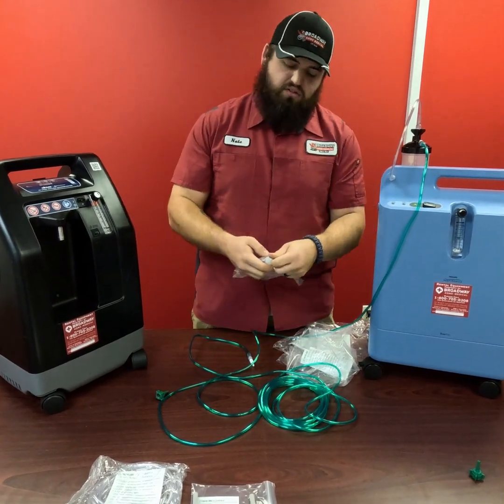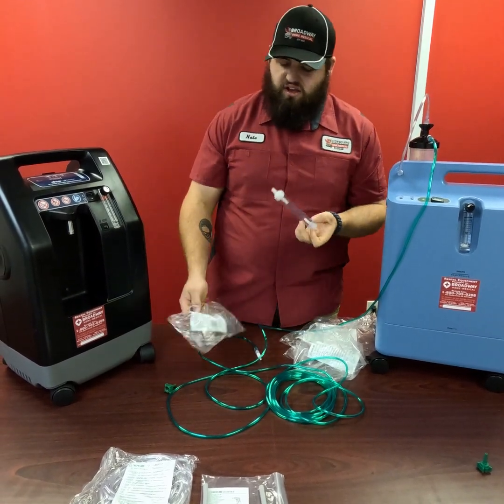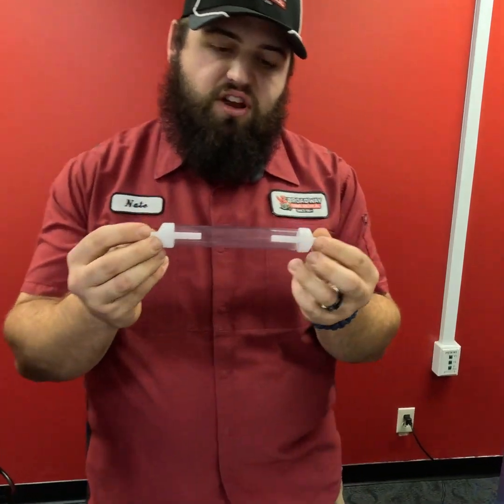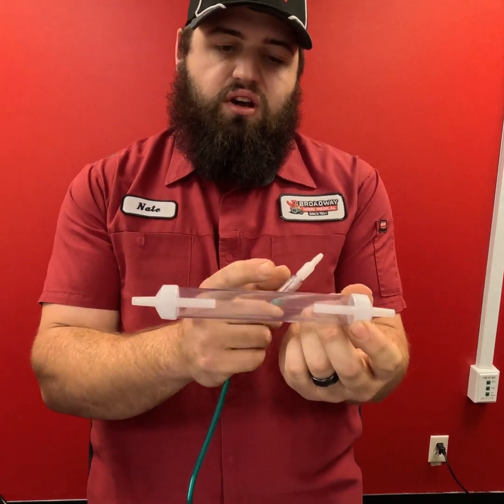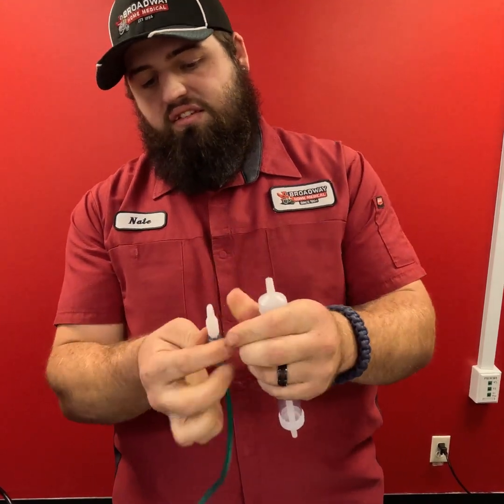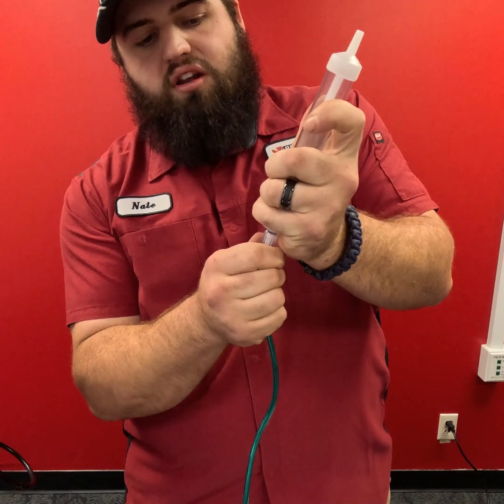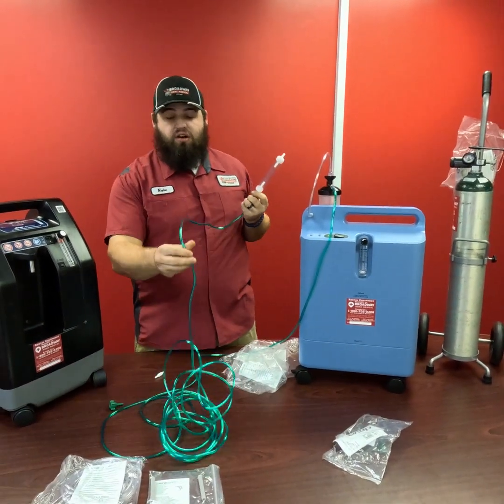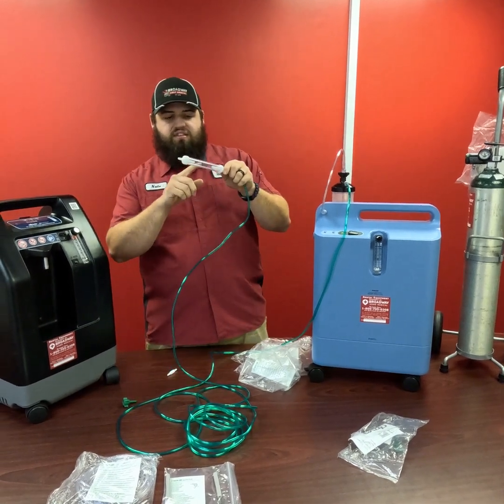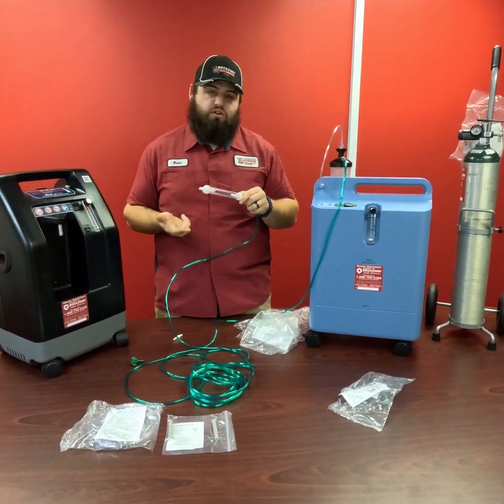One other thing here is going to be a water trap. Now I do suggest, if you're going to use the humidifier jar, to go ahead and consider the water trap. Now this water trap takes place of the swivel. If you're going to use the water trap, you'll basically just take this swivel out. We'll just pull that out, and you'll replace it with the water trap. Now what this does is sometimes whenever you are using a humidifier jar, you can experience a little extra water coming through that hose. And what this does is it's going to actually catch that little extra condensation and keep it from going all the way up into your nose.